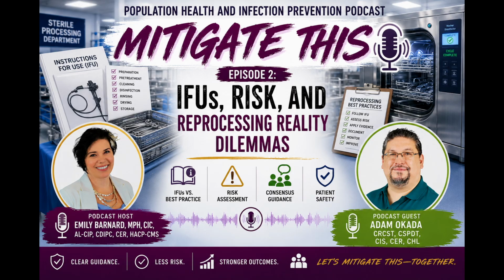I could think of a product recently, just observing some opportunities in sterile processing and looking at different types of brushes, or how you're cleaning your instruments, and even the devices used secondarily to clean these instruments. Well, it could potentially serve a purpose. However, when you get down to the nitty gritty components, it could be the composition of this product, how it's designed, the integrity of it, and then going to those standards, such as AAMI standards. I think in particular it's ST79. That's one that really speaks about the composition of brushes in particular.